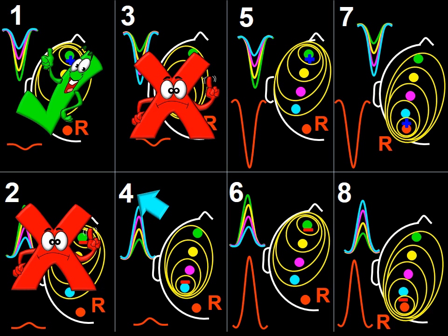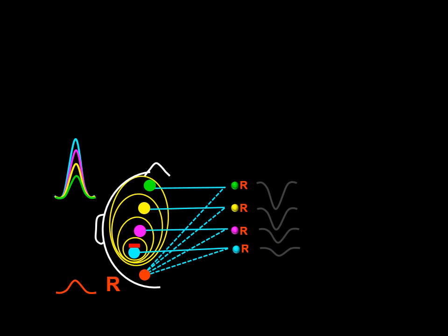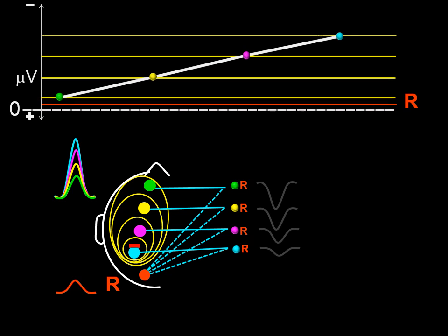Next, we should consider option 4. In option 4, we are dealing with an occipital polar negative field being referred to a minimal negativity represented in the scalp at the time of the recording. This frame represents an isopotential map corresponding to option 4 and the waves in question. Now I have added the corresponding voltage graph.